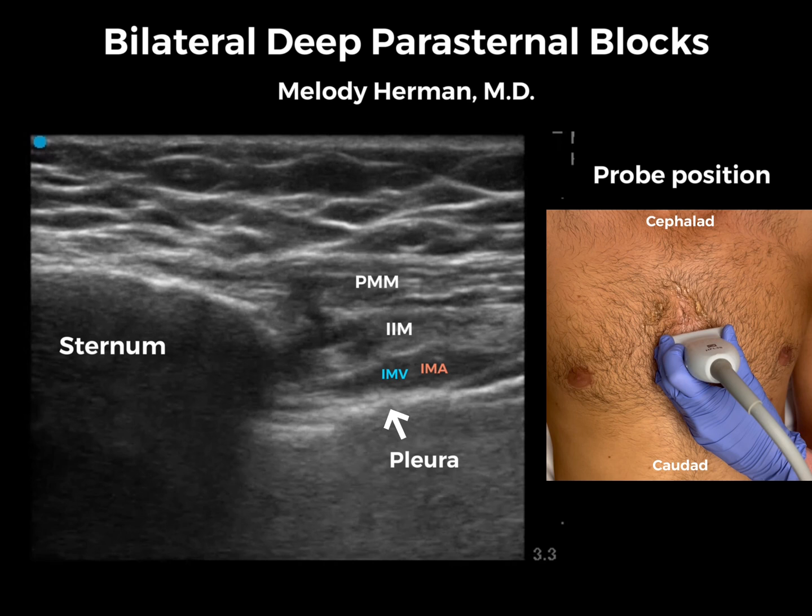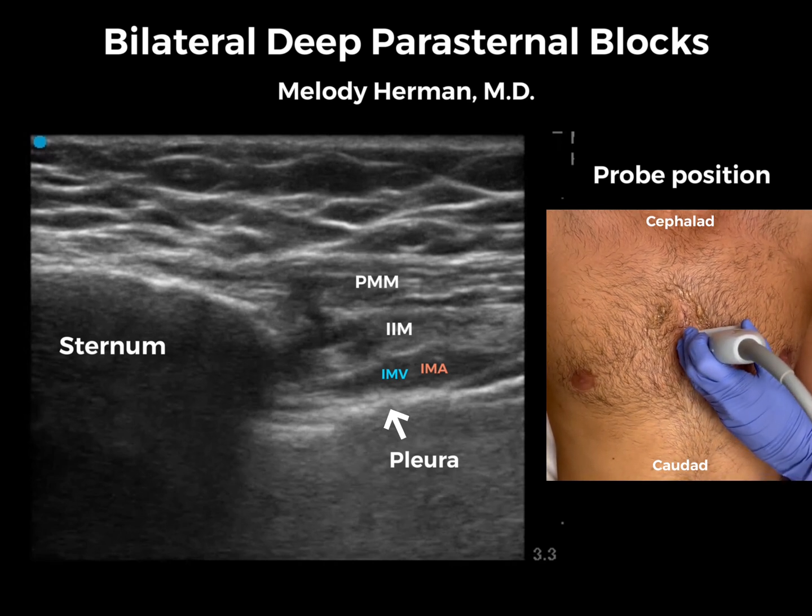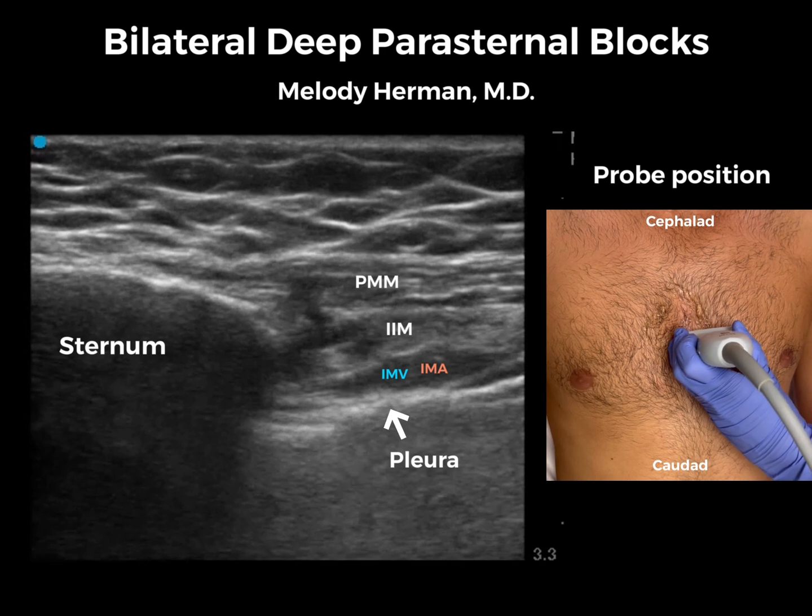You don't actually have to do it this way — you could just do a shortcut and put the probe in the transverse orientation over the sternum, find your mammary vessels in between the rib spaces, and go from there. I just like to do it this way, so that's how I do it.